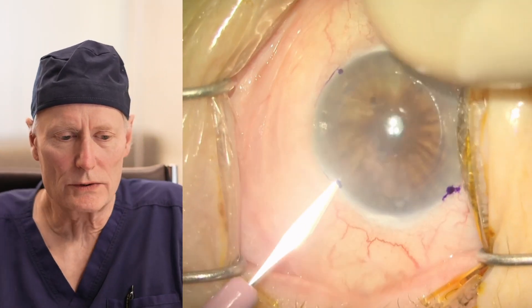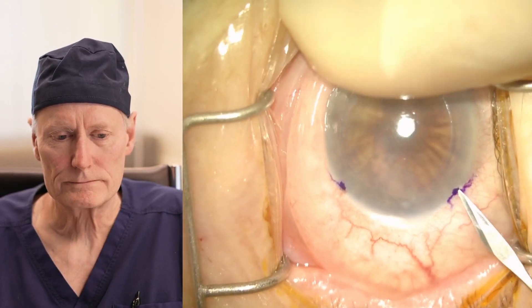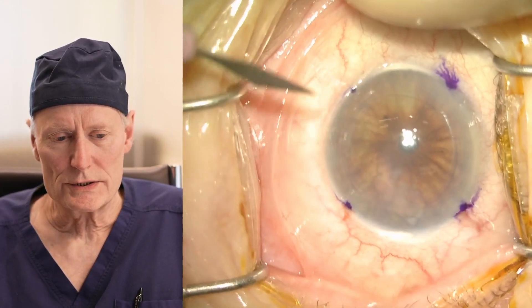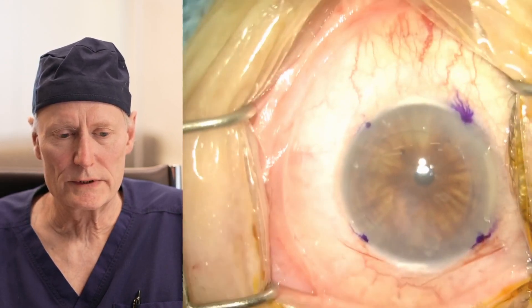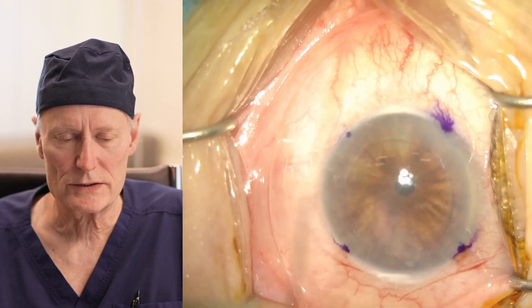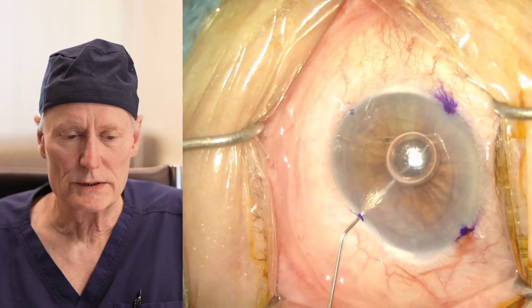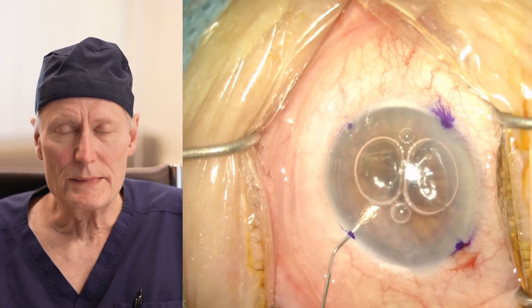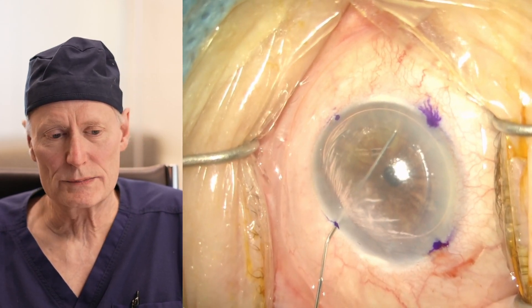This is the whole case. It's not edited, except it's sped up about 25%. The surgery starts off with three little punctures in the eye. These are very similar to the incisions made with cataract surgery — in fact, these are exactly the same blades we use for cataract surgery. With DMEC surgery, the first thing we do is put a little air in the front part of the eye to support the cornea.